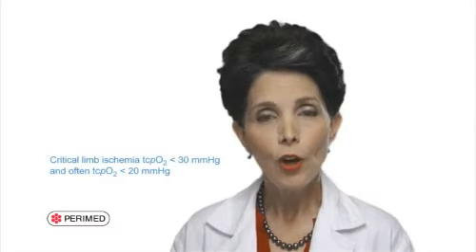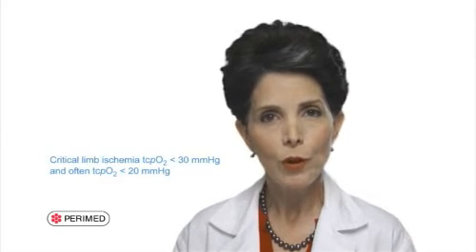Now let's discuss screening for vascular disease, or assessing the success of revascularization. Patients with critical limb ischemia will almost always have a TCPO2 less than 30 millimeters of mercury, and often less than 20 millimeters of mercury. However, as we've already mentioned, low pressure values can also have other causes. So how can you know if the low values you see on a patient are due to arterial disease?